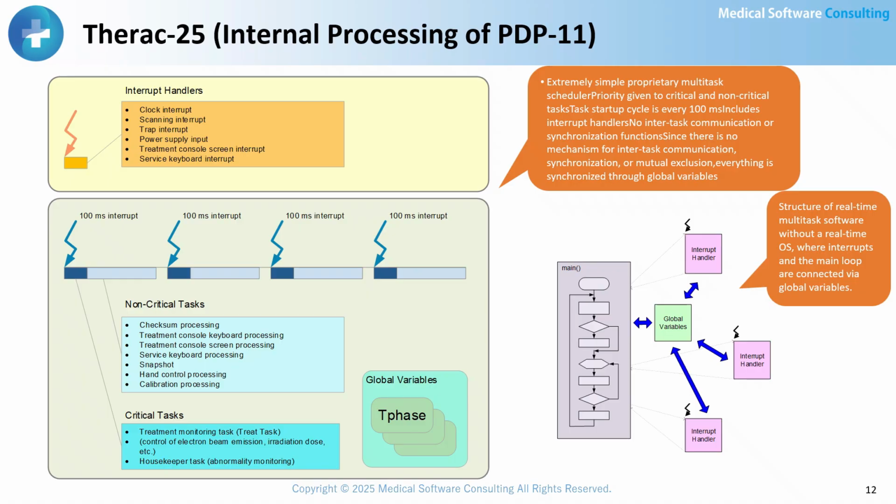It is not uncommon for software engineers to carry the design in their heads without leaving documentation. But in medical device software, when an accident occurs after release, it is critical to investigate the cause quickly and implement countermeasures. That is something that requires documentation of the software.